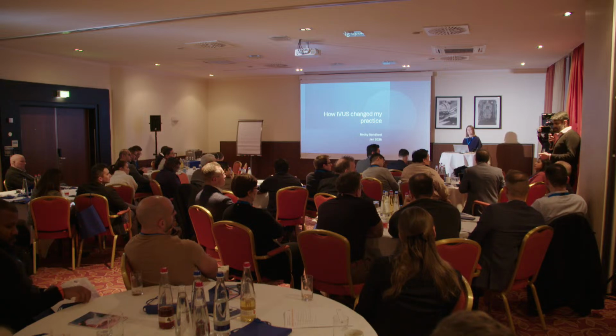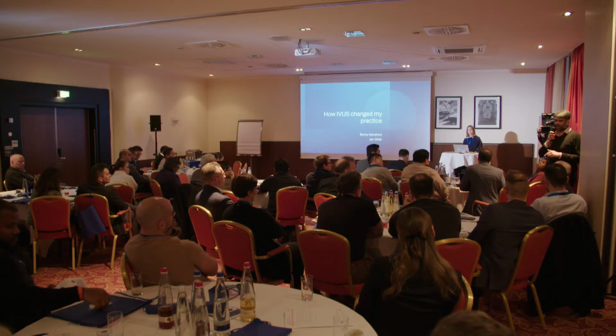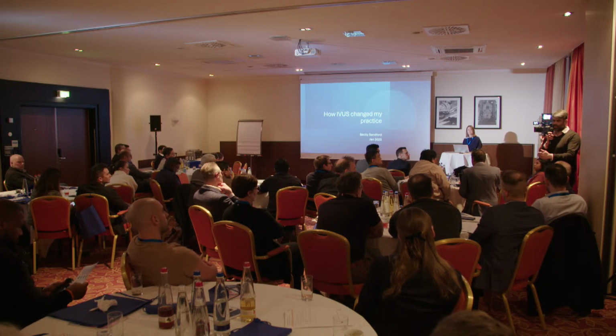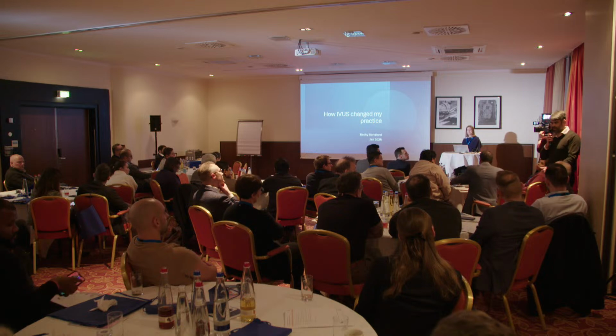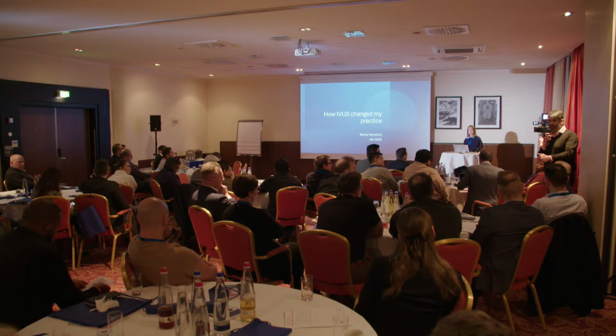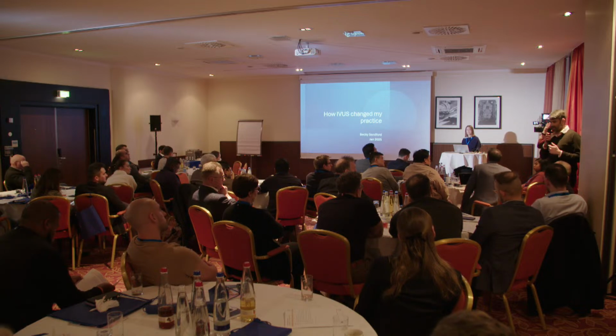When the tibial vessels get larger, when I know they're going to have an amputation that's going to result in a larger wound, for example, a transmet or multiple digits, where I need the revascularization to stay patent for longer to allow time for tissue healing, then maybe IVUS. So there's a lot of inputs that go into that decision making.